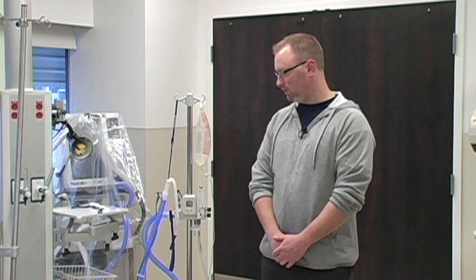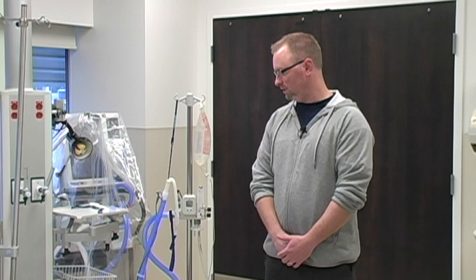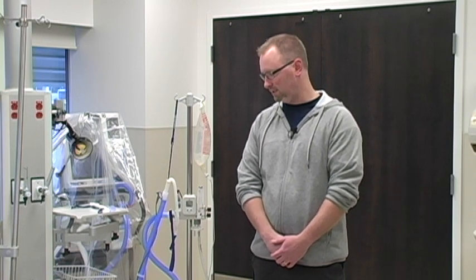I'm a respiratory therapist at Royal Inland Hospital here in Kamloops, and today I'm going to be talking about the Optiflow. So what is Optiflow? Optiflow is a high-flow oxygen delivery system that heats and humidifies the gas to body temperature and delivers it to the patient through either a nasal prong or a trach interface.